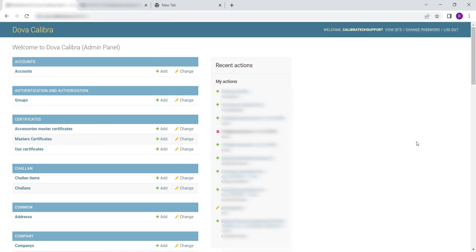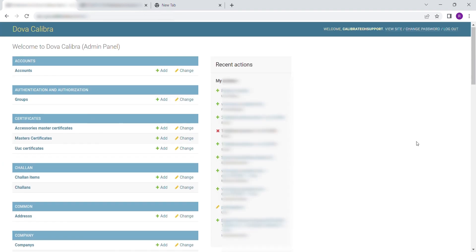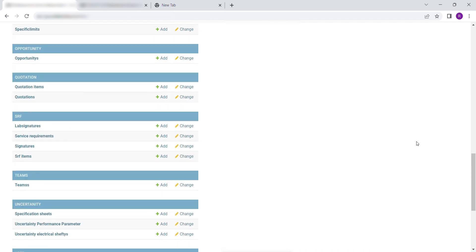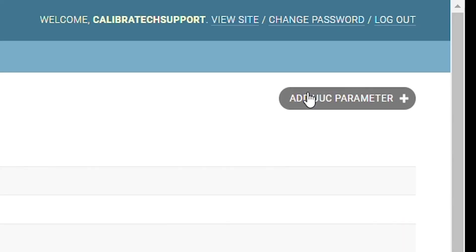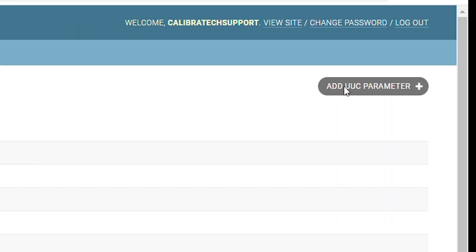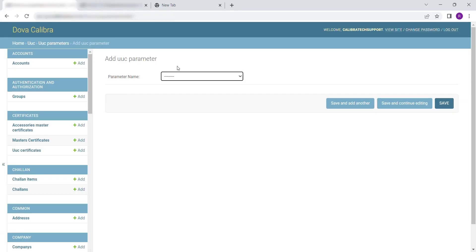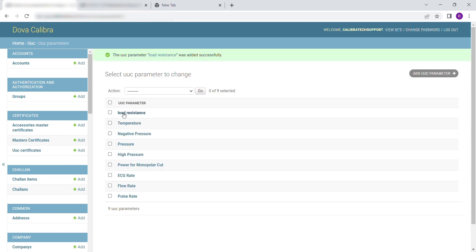To add UUC Parameters, scroll down to UUC. Select UUC, then click on UUC Parameters. Then click on Add UUC Parameters. Select the Parameter from the drop-down. Click on Save to save and exit, or Save and Add Another to continue entering UUC parameters.